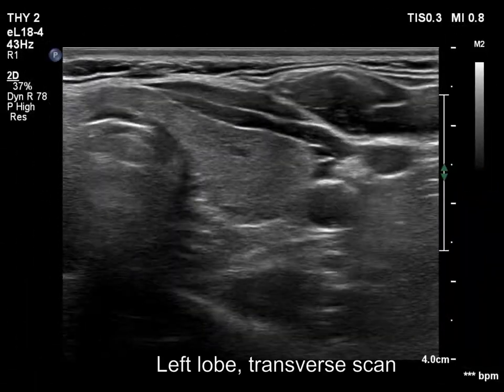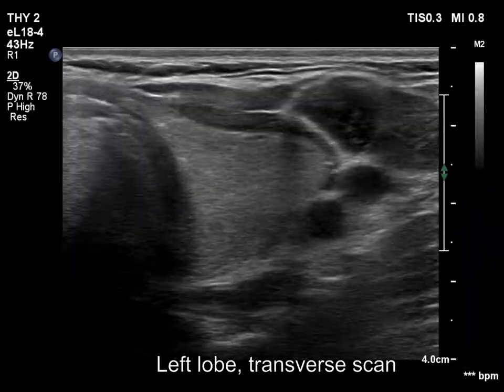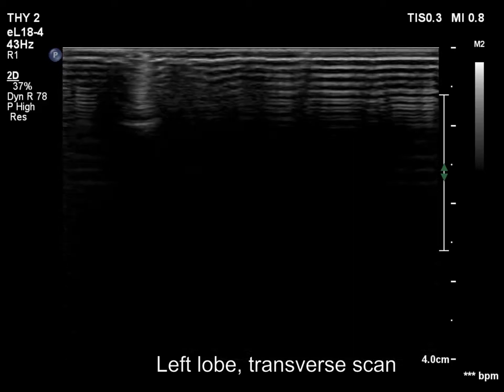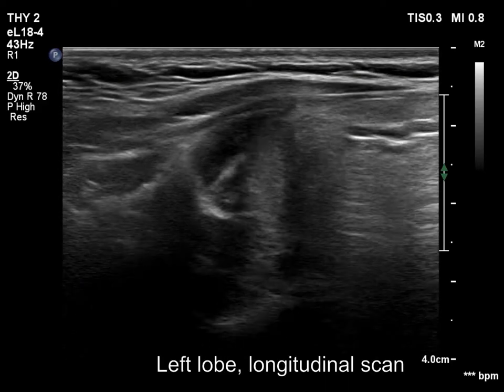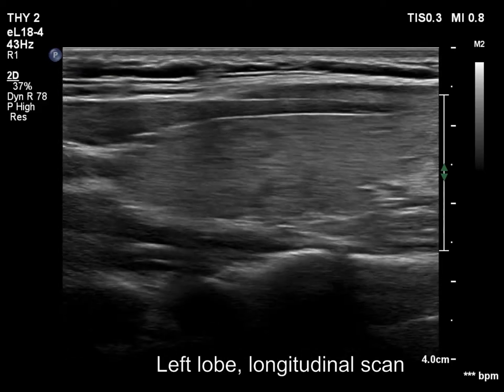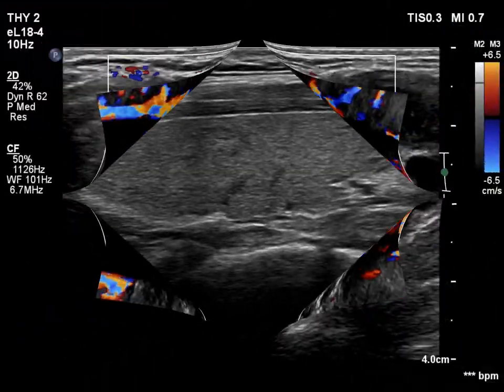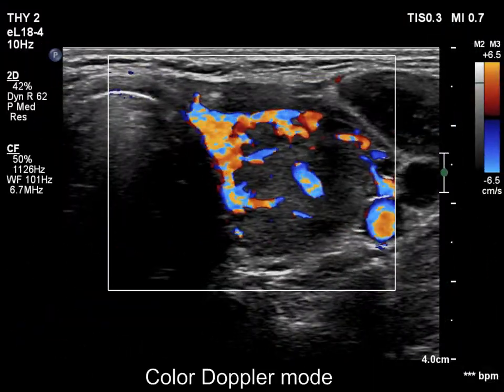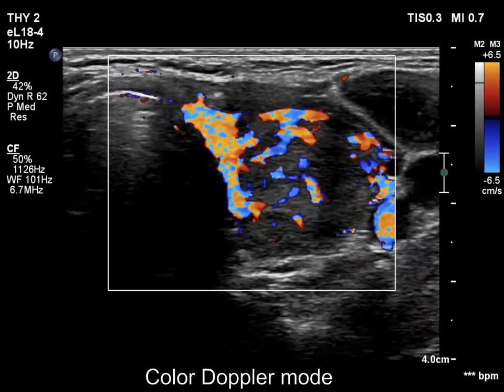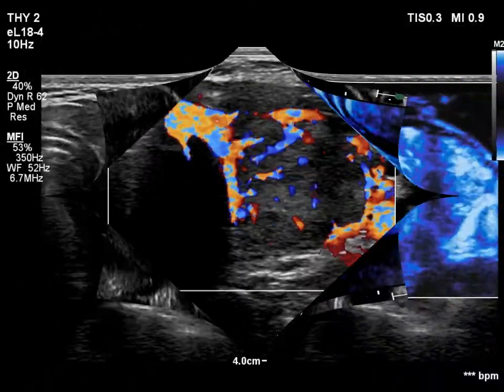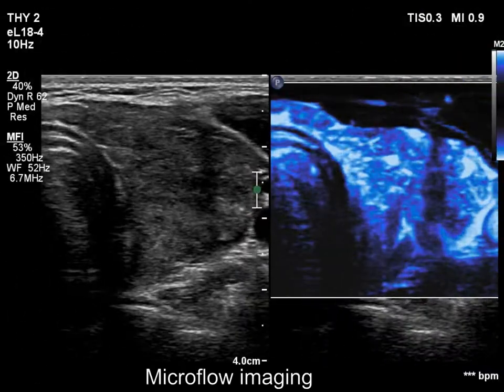The left lobe has a similar presentation — it has several tiny hypochoic areas. The vascularity is increased both on color Doppler mode and on microflow imaging.